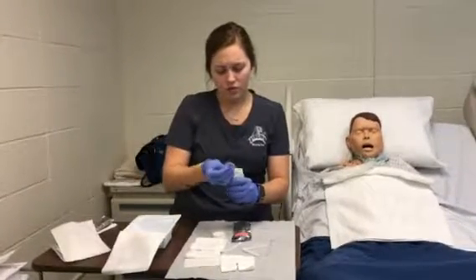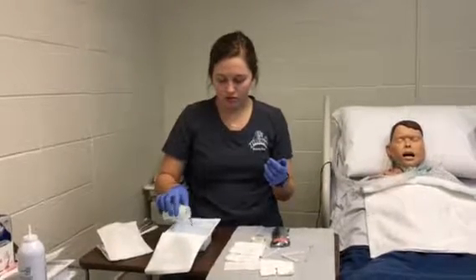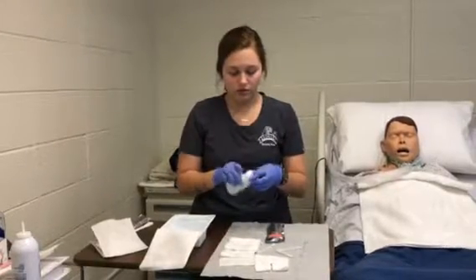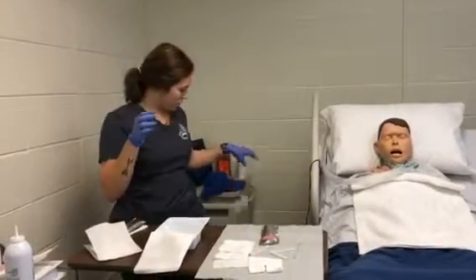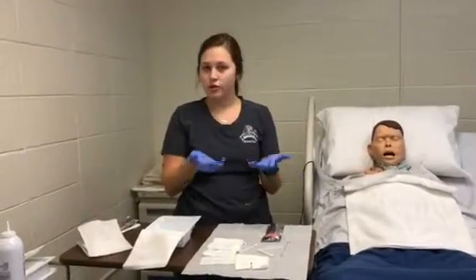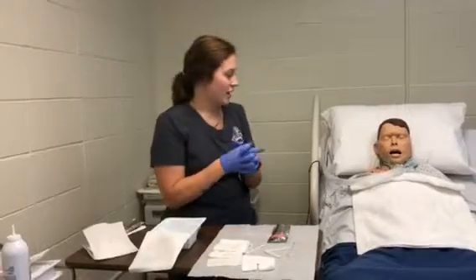into the kit. For demonstration purposes, we can't use hydrogen peroxide on the mannequins, so I'm just going to use saline for both. But if this was on a real person, you would definitely use hydrogen peroxide. Go in the trash. Okay, so now that I have this all set up, if it was a real person, you would do sterile water in one side and sterile water and your hydrogen peroxide mixture in the other.